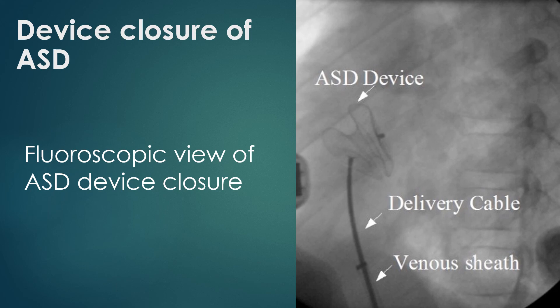Position is confirmed by transesophageal echo with special care to ensure the device does not interfere with the functioning of the atrioventricular valves. Once everything is confirmed, the device is released by unscrewing the delivery cable.